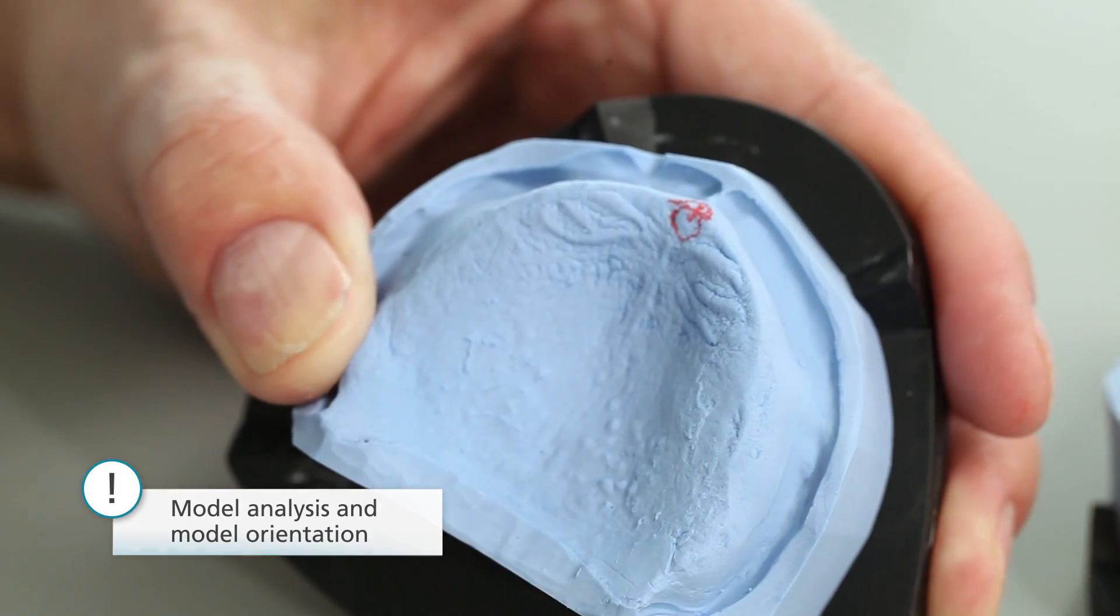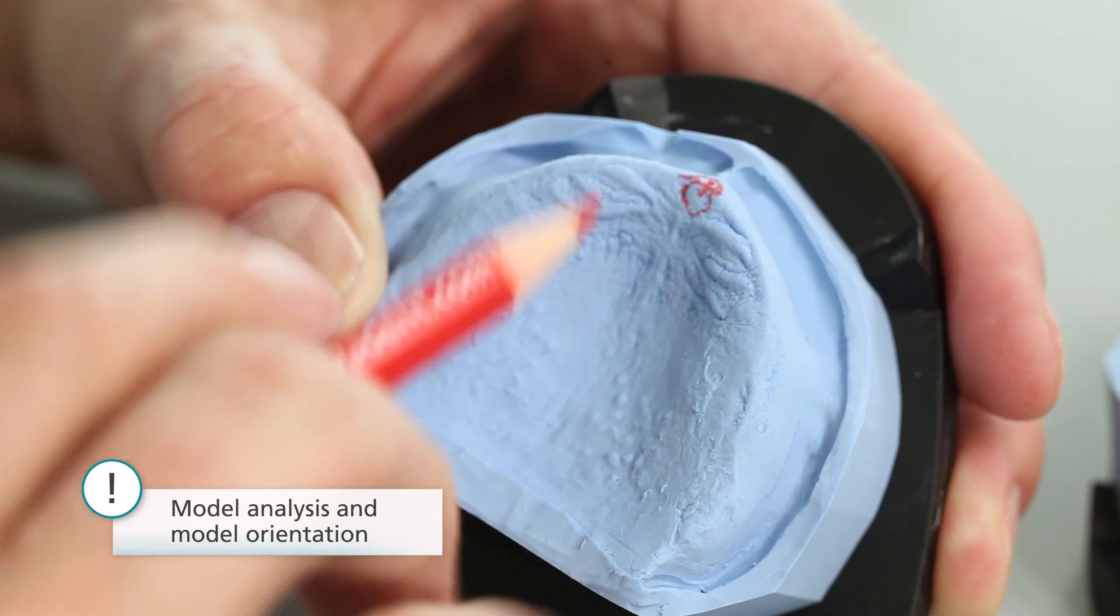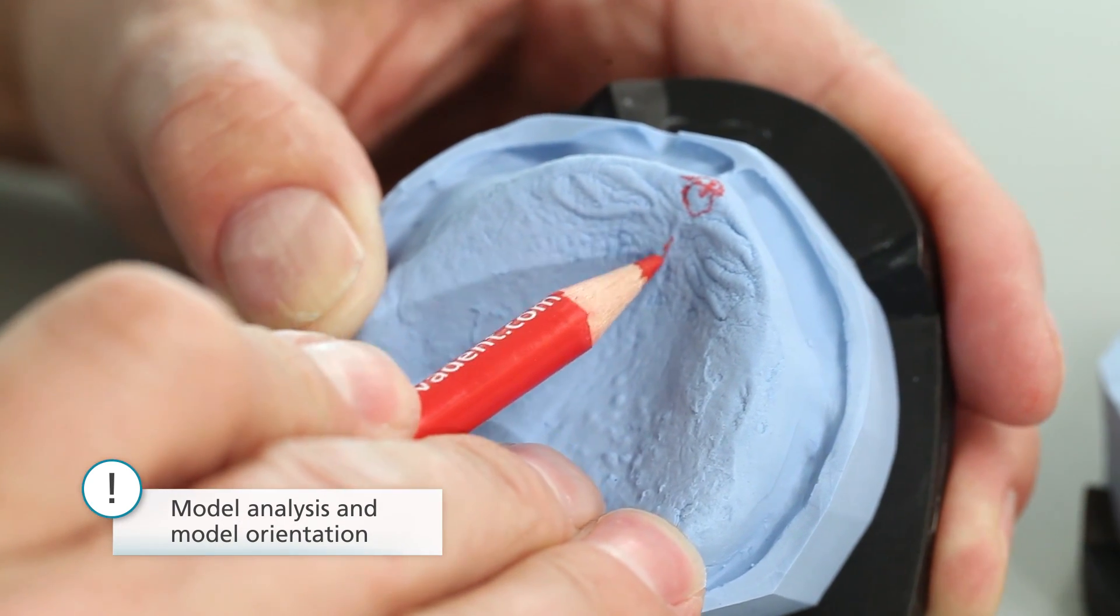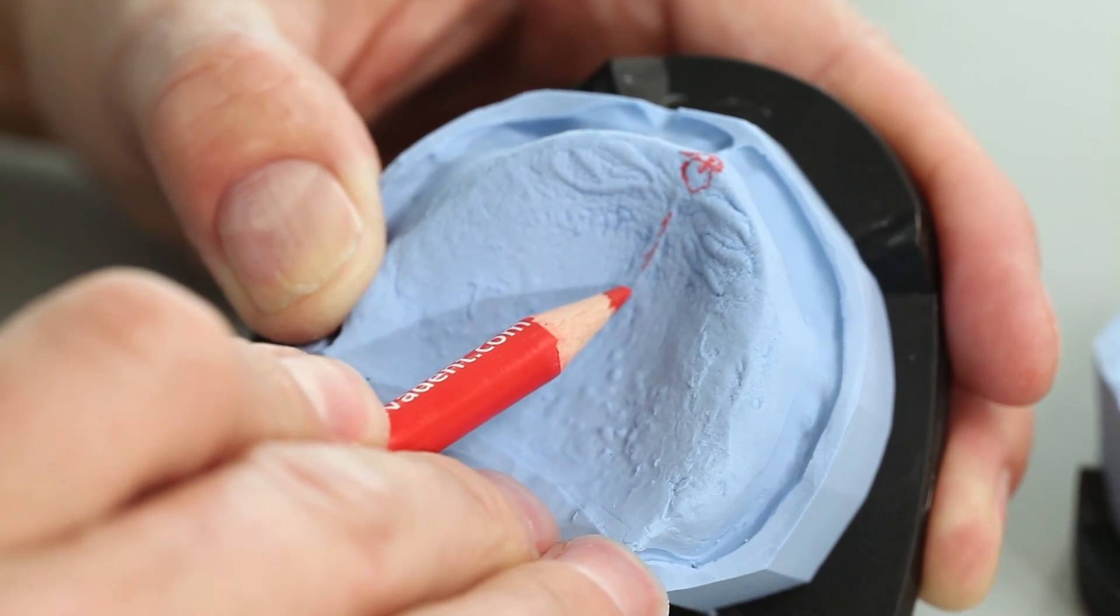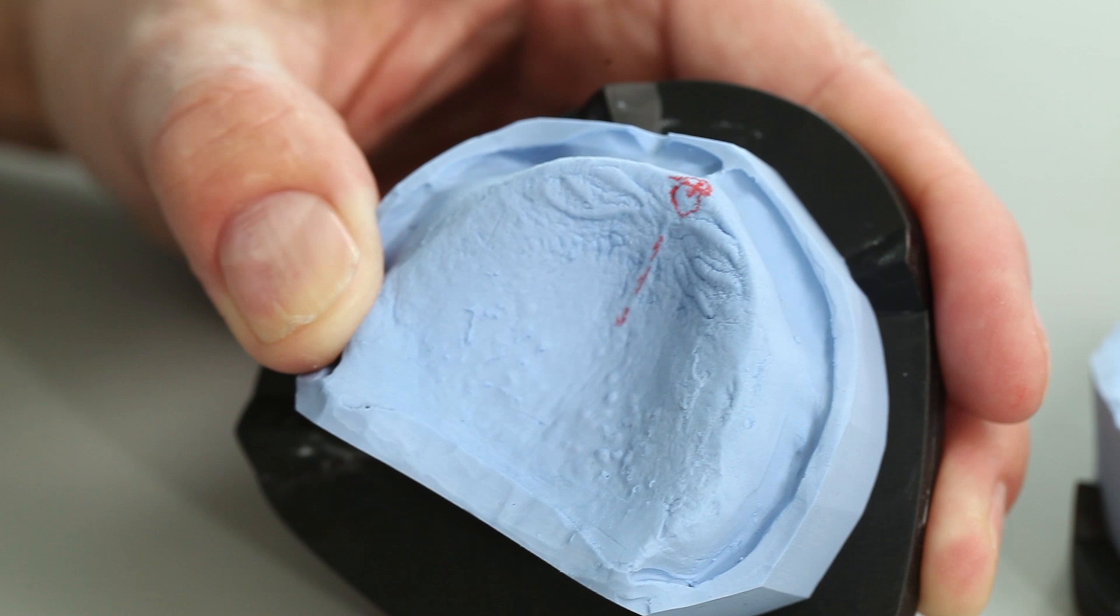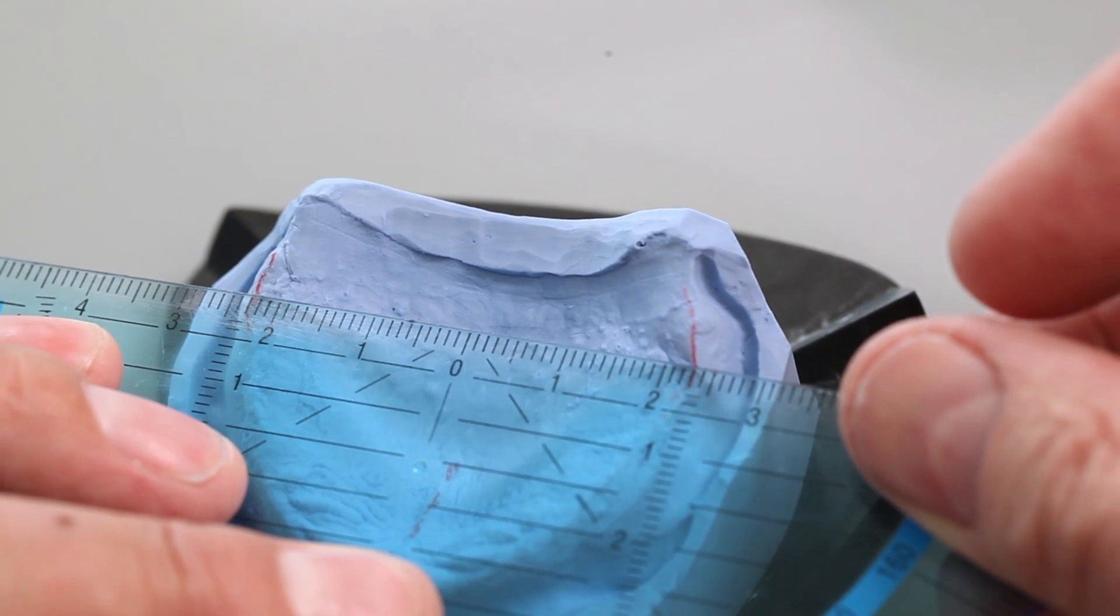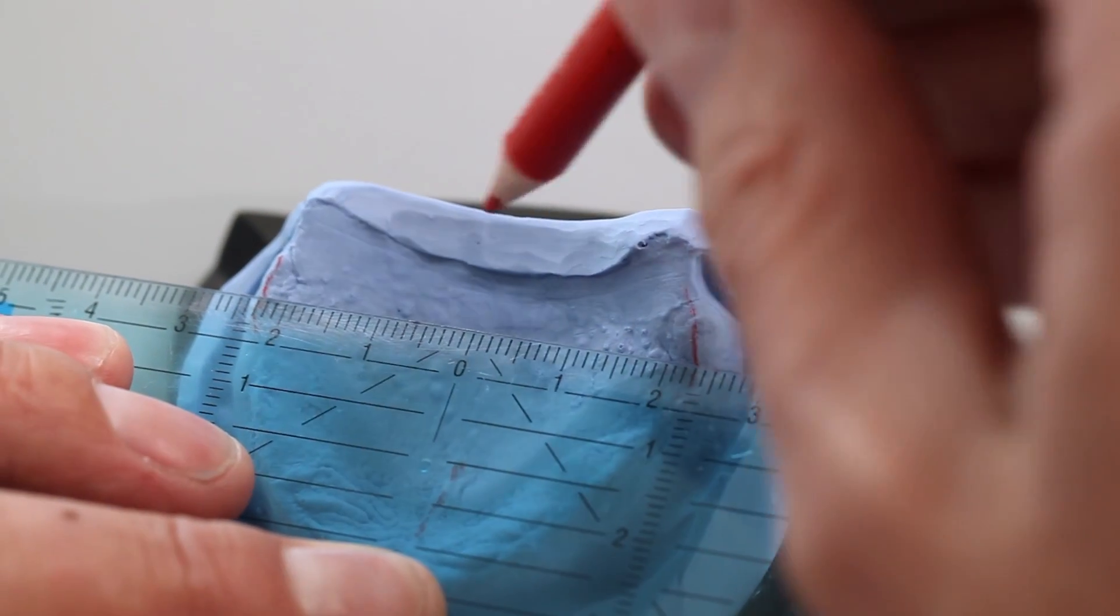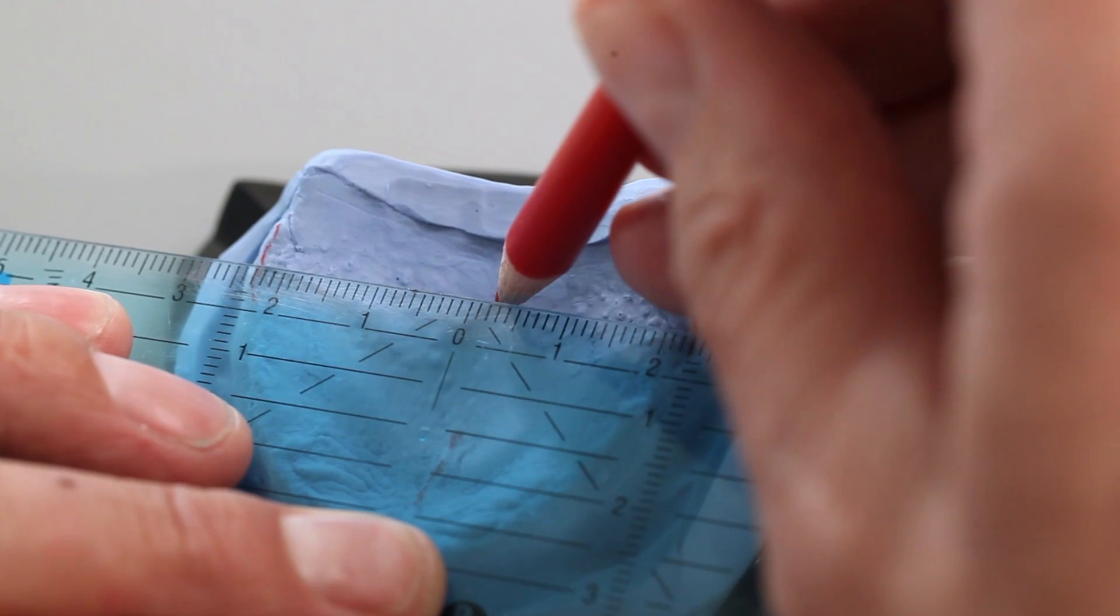The following reference points must be observed for the correct model orientation. The incisive papilla and palatine RAFE provide the anatomical midline. Mark the highest elevation of the tuberosities on both sides. This allows you to determine the dorsal centre.